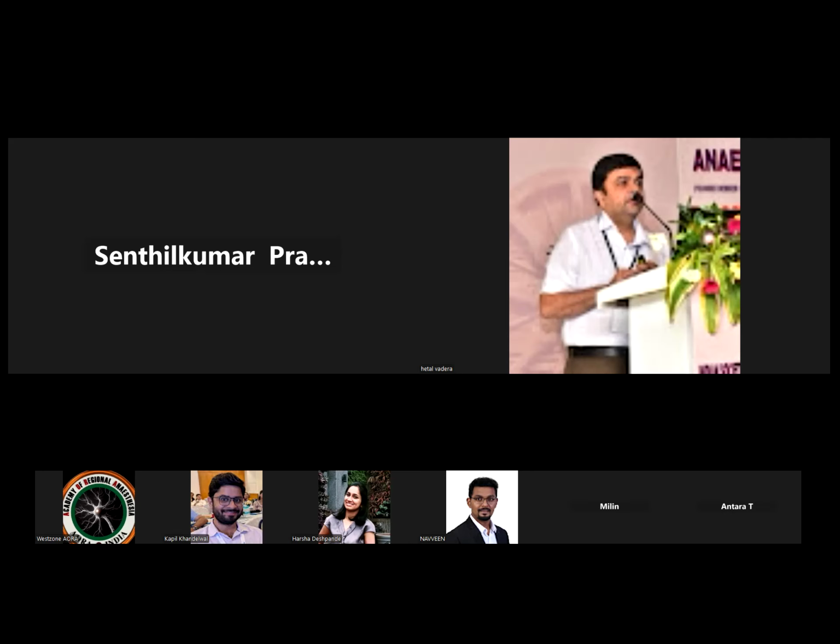Yeah, please. Sir, can we approach the lumbar plexus through the transverse approach, sir? The trident sign approach. Yeah, I have tried it once or twice. We can do it, but it is difficult to visualize the needle. So it is more or less like an out of plane approach or blind approach. You hit the transverse process and advance the needle, and you can go through it. I have done it 2-3 times. Okay, sir.